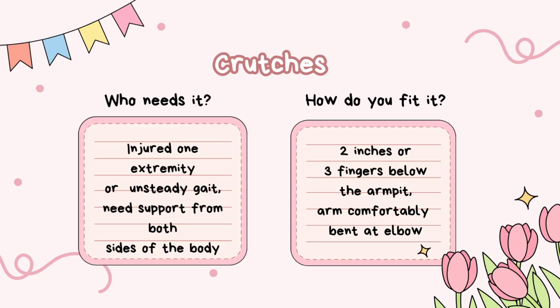How do you fit it to your patient? Well, the crutches should be 2 inches or 3 fingers width below the armpit, and their arms should be comfortably bent at the elbow.